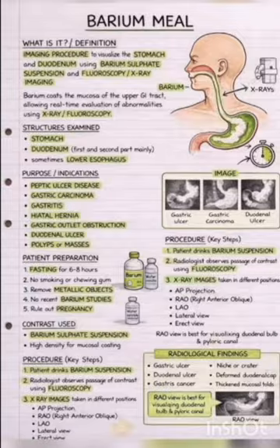Then contraindication. Contraindication means a condition or reason why a particular test or treatment or procedure should not be performed because it may be harmful to the patient. First one is complete large bowel obstruction, and suspected perforation, suspected fistula, recent biopsy of GI tract and suspected pregnancy.